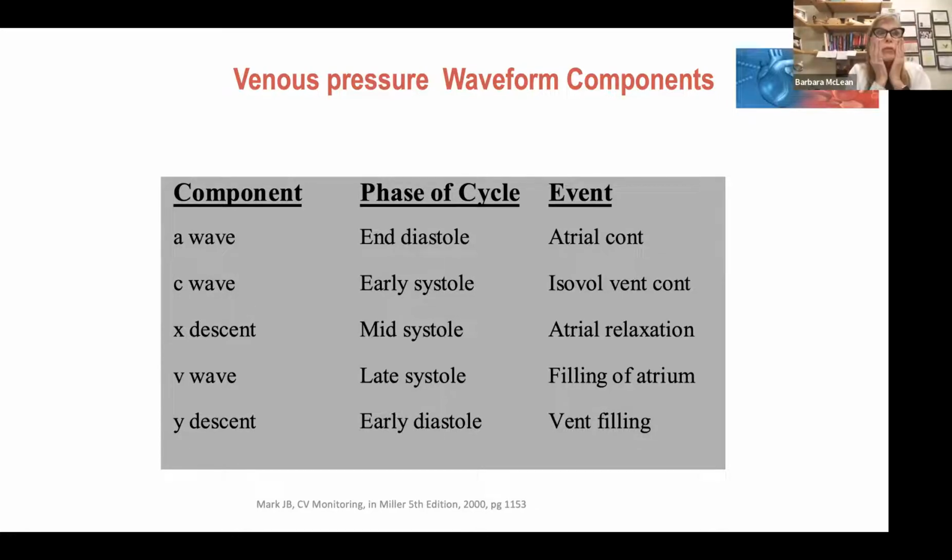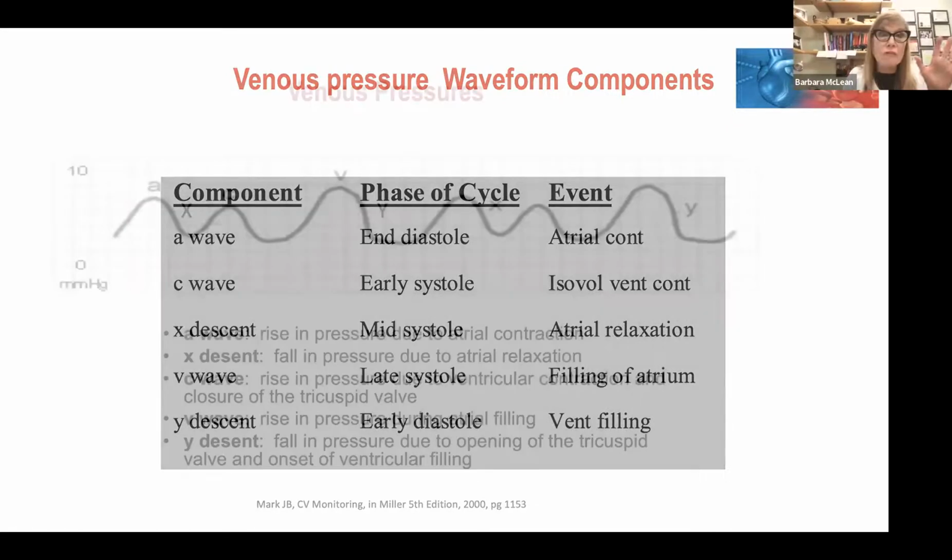Oh my God, you said. Maybe you knew, but most people say, I never knew that about the venous pressures. I'm not looking at A waves and V waves on my venous pressure and the CVP. And everybody here might not take care of a patient with a PA catheter, but every one of you takes care of patients with a central line. Every one of you. You should be looking at those waveforms because those waveforms are incredibly and profoundly telling about what's occurring for your patients. So that's all venous pressures.